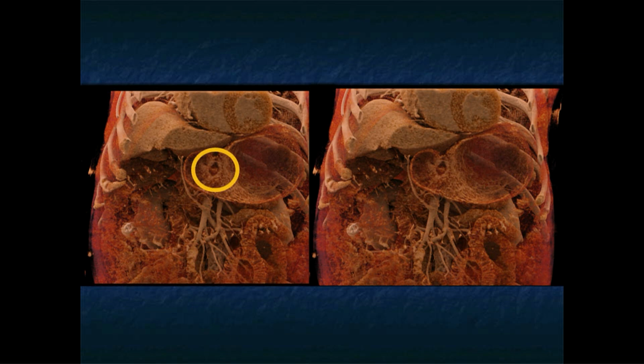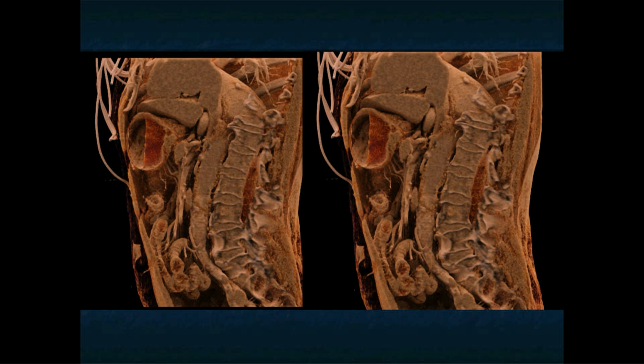So one of the things we're able to do with cinematic rendering, and I think when I speak about AI, I'll mention it tomorrow perhaps, is that AI is going to impact things as simple as 3D imaging. Right now it takes a little bit of time to create the 3D images, and most people don't spend the time or bother to do it. But looking forward, AI will be able to create the right renderings, which are very variable with cinematic rendering, to show you those ulcerations. So again, that should improve our ability to work on this.